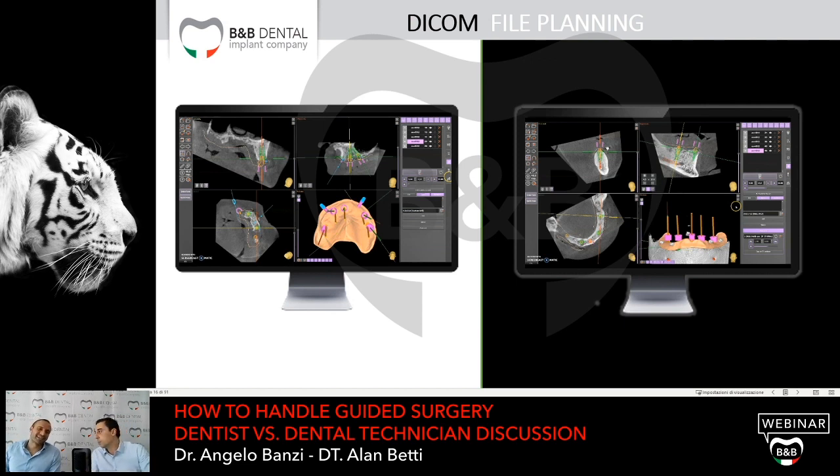Remember that for every trick that I play, I have to pay something, because sometimes when I move 2 or 4 millimeters, in the end I have to work with an implant shorter by 2 or 4 millimeters. But to avoid having the implant 2 millimeters above the level of the bone, or to avoid the opening of a flap, sometimes this trick works.